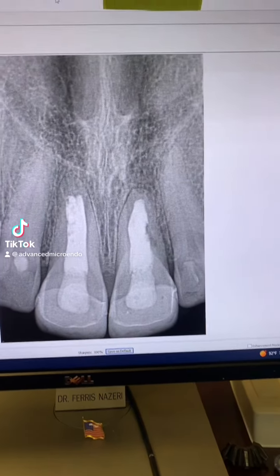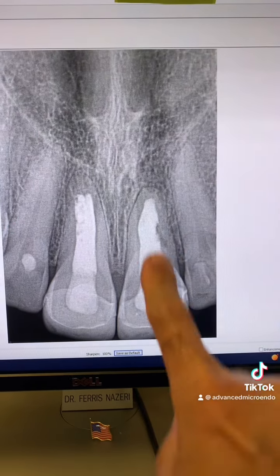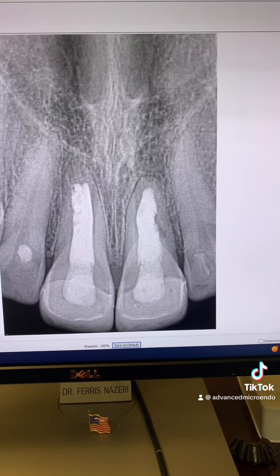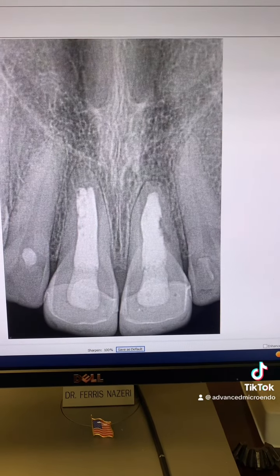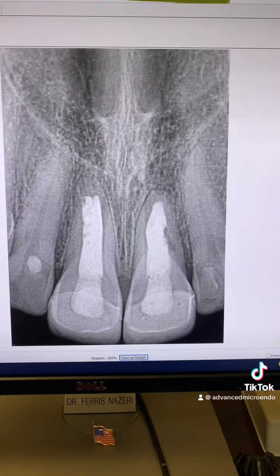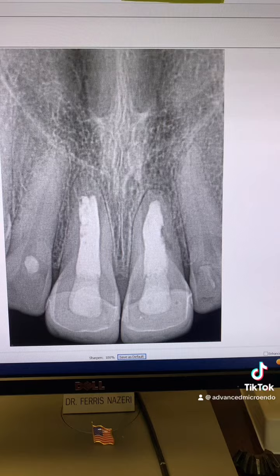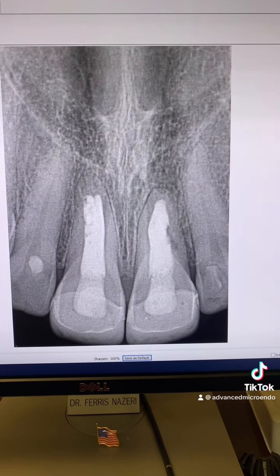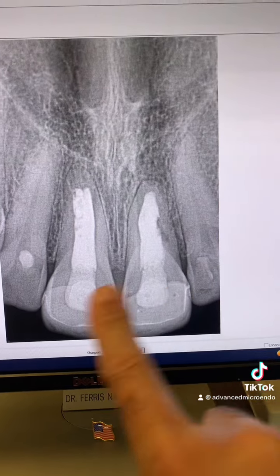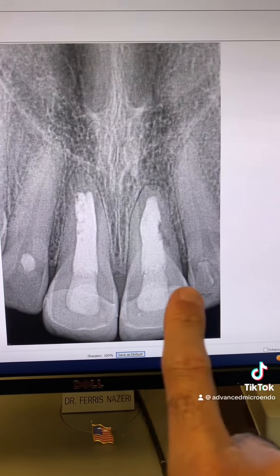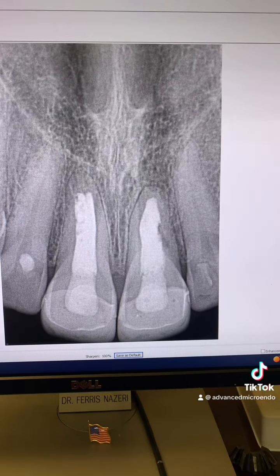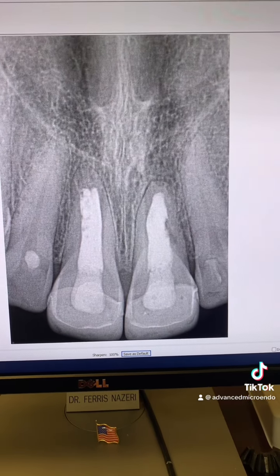Who remembers this case? This patient was referred to me for endodontic retreatment of tooth number 9. I posted it and asked your opinion about what's going on with the tooth. The patient is 41 years old now. When she was 10 years old, she traumatized her front teeth and they did root canals for her — about 30 years ago.